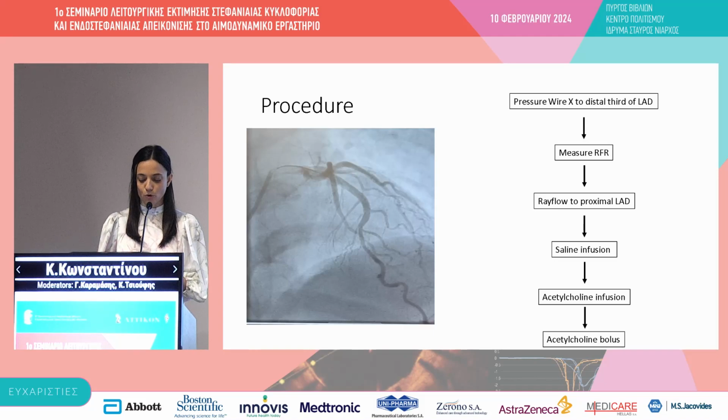And then we go on to give the acetylcholine infusions. We do need resting and hyperemic. We need resting flow more than anything, because our acetylcholine flow will have to be compared to the resting flow to check how it's changed.